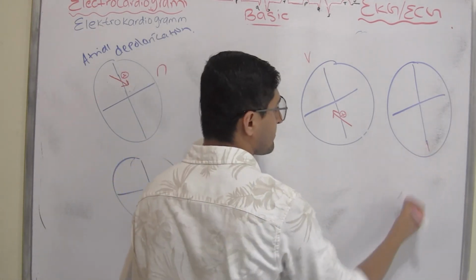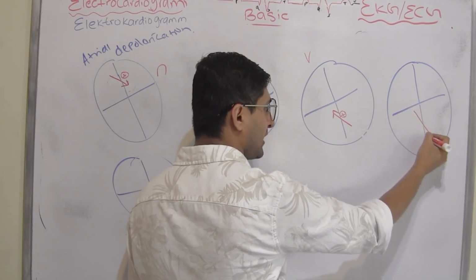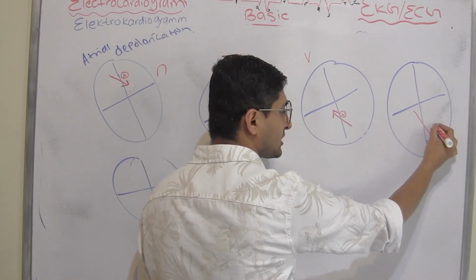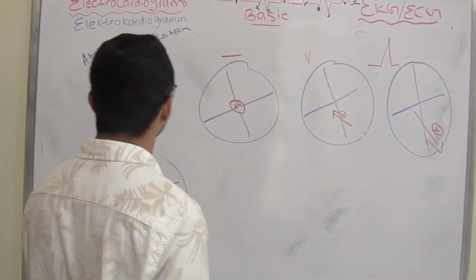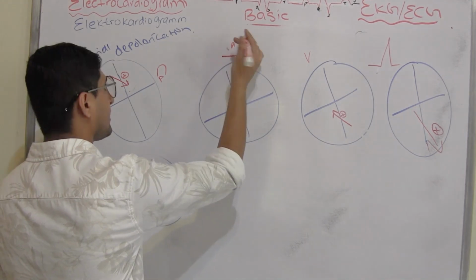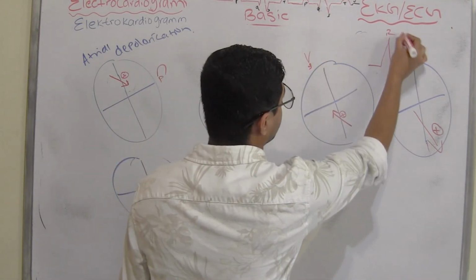And what is this? A major ventricular depolarization, right? Remember what we said? Long vectors are produced, going downward to the left because the left ventricle is thicker, and it is positive. So that way you make this long complex. This is P. We'll say PR segment. For this one we'll say Q, and we'll say this is R.